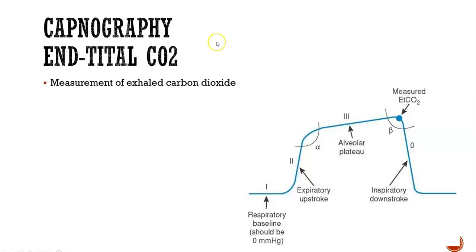Okay, I already talked about end tidal CO2. It's just the measurement of that exhaled carbon dioxide. So on the respiratory baseline, we have the expiratory upstroke, then the plateau. This is where that end tidal CO2 is measured, and then the inspiratory downstroke.